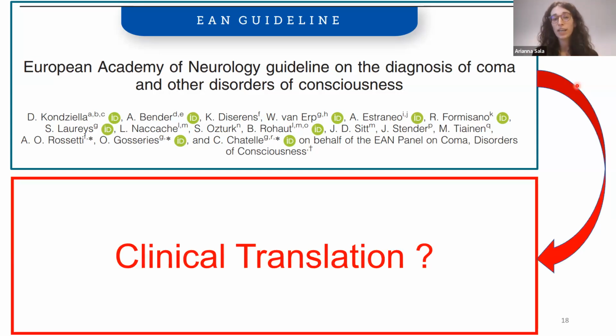Still, this evidence, again, is based on the type of metrics that I have shown you. These metrics are not something you just get. You do the PET scan, you get the images, and you just visually assess the raw images. These metrics require some data analysis, some processing, which is not necessarily available in all clinical centers. It requires quite huge technical expertise.